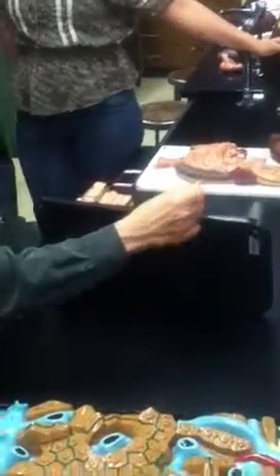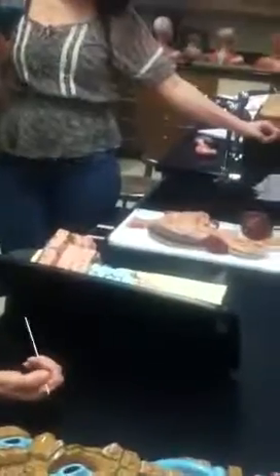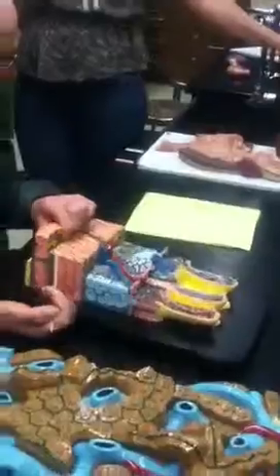And they secrete into this crypt of Lieberkühn. Again, a German. Yeah, they're all Germans in connection with this stuff. Crypt of Lieberkühn with the Paneth cells surrounding it. Okay? So that as bacteria from inside here manage to get down into these crevices, pow, the Paneth cells destroy them, and if they don't, they end up being murdered by the lymphocytes that are wandering around here. Who's left? Crypt of Lieberkühn.